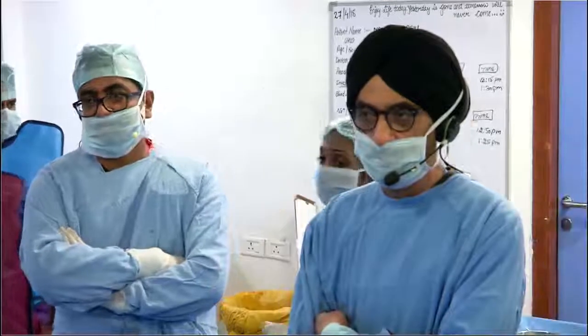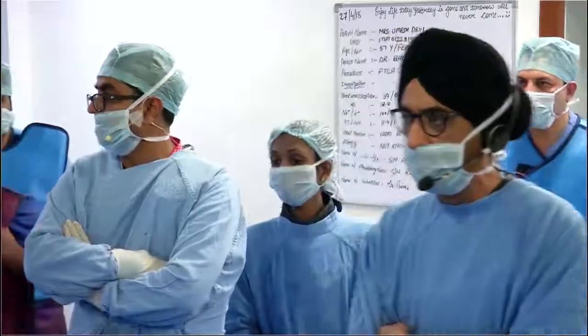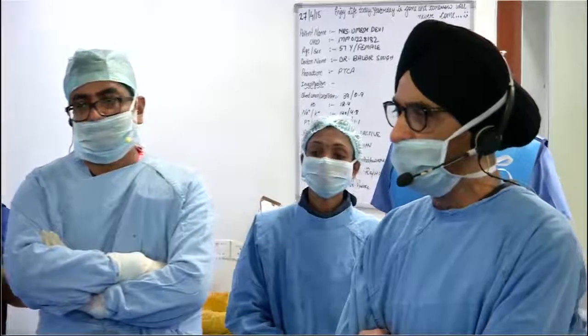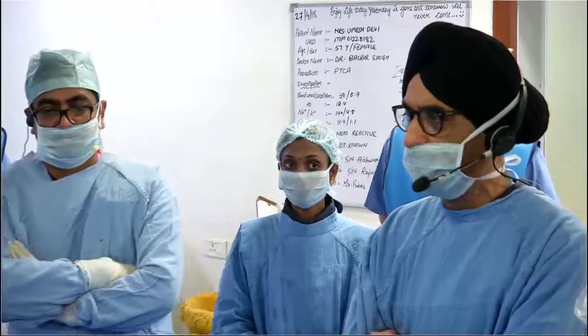What do you think about the pressure? Why is the pressure down now? I mean, she started with a... No, the pressure is fine. It's the pulmonary artery pressure that I'm mentioning. Her pressures are 120 by 80, saturation of 98. She's very comfortable. That was the pulmonary artery pressure that I was telling you.